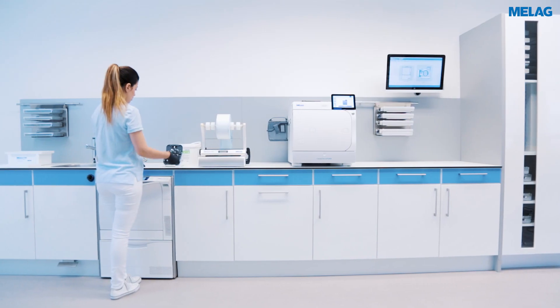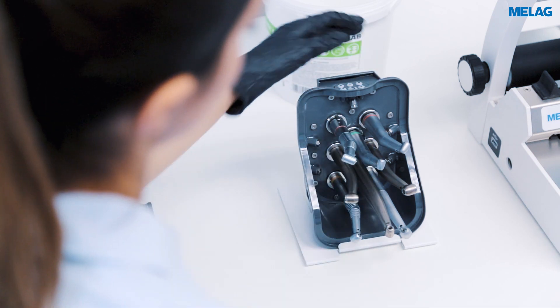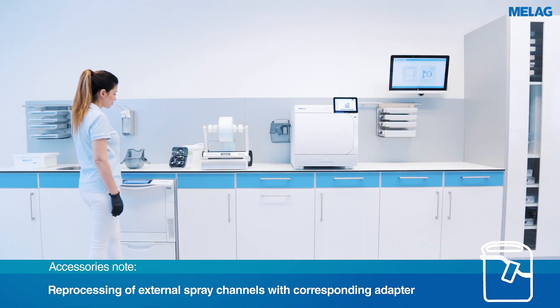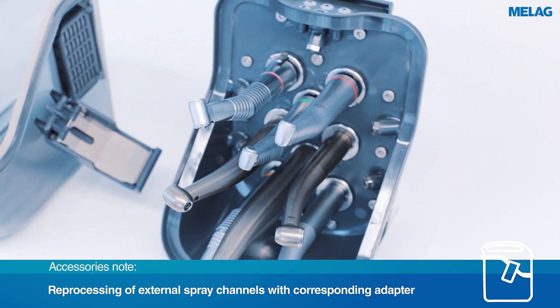Insert the transmission instruments onto the adapters as far as they will go. Please check that they are correctly fitted by gently pulling on the instrument. For an optimal reprocessing result, the openings of the chuck system should face inwards as shown in the video.